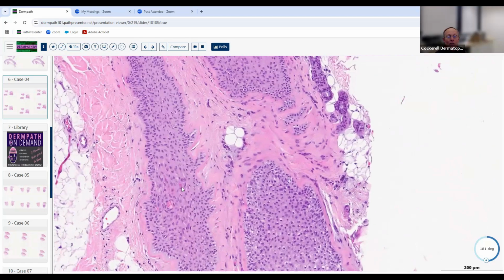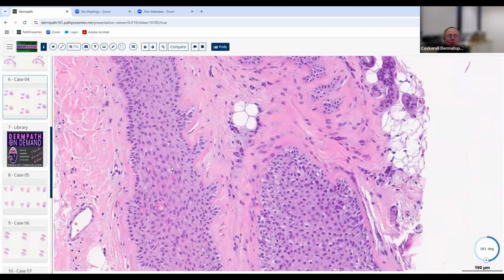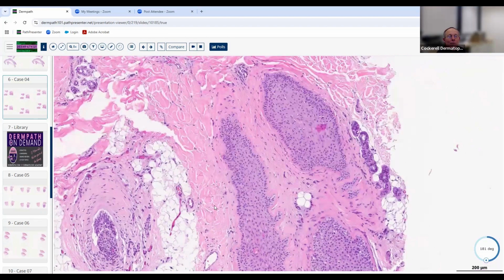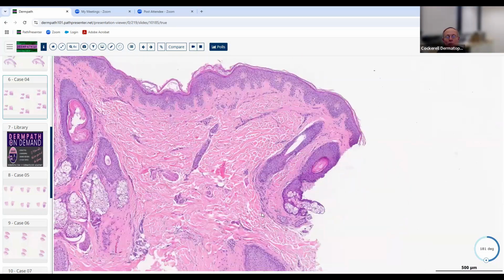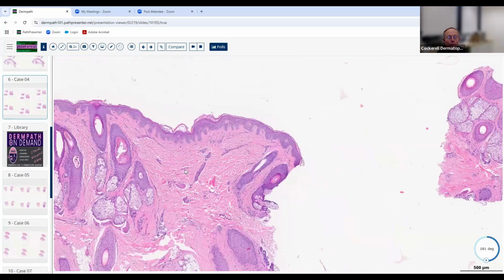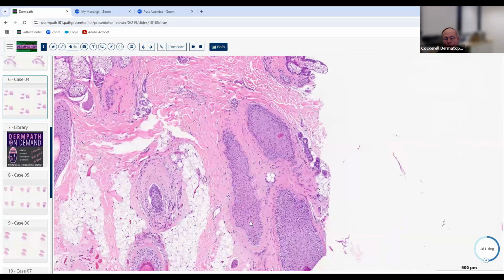And so these individually necrotic keratinocytes and the thickened glassy basement membrane zone, this whole thing is contracting. It's going to end up as a fibrous streamer, a little tiny strand of collagen with a small bud of cells in the area of the isthmus, and it may lead to a new follicle that may form at some point in the future. So that's catagen. If you see dyskeratotic keratinocytes in a follicle, it means catagen.